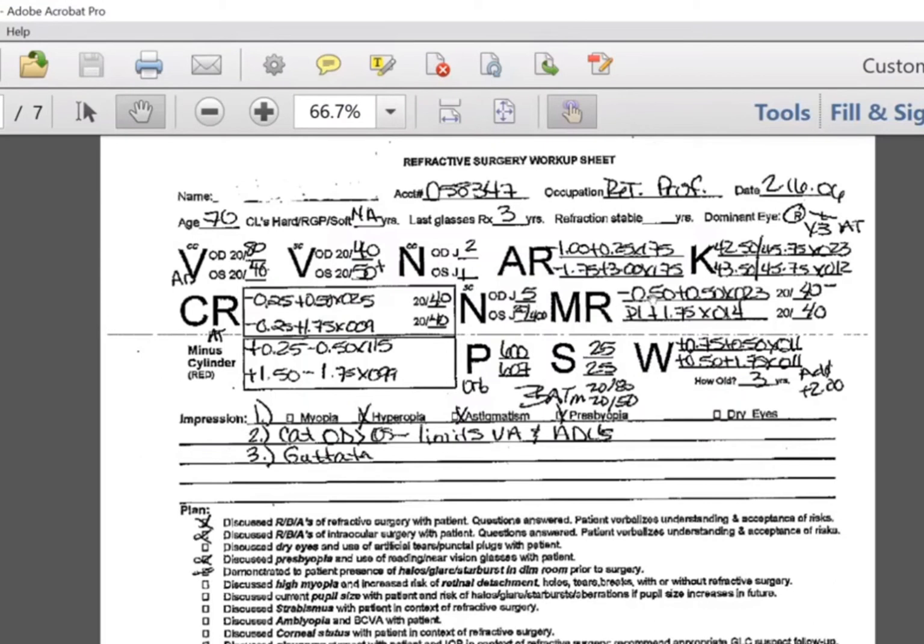Right, so you will notice that there's some difference in the refraction that has been measured simply because of the difference in the instruments. Usually for objective refraction using an auto-refractor, the measurements are more myopic. So you can see here in the results, the auto-refractor readings are more myopic compared to the manifest refraction, the subjective refraction here.